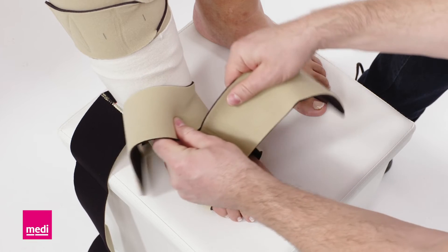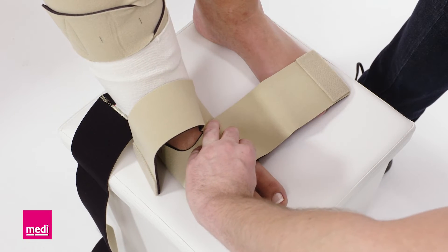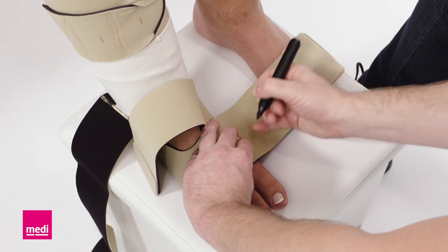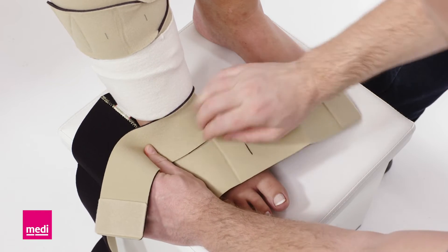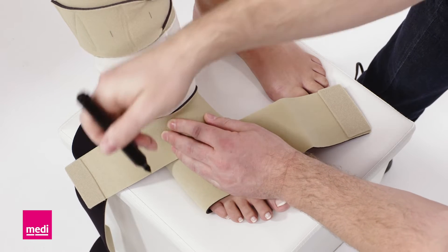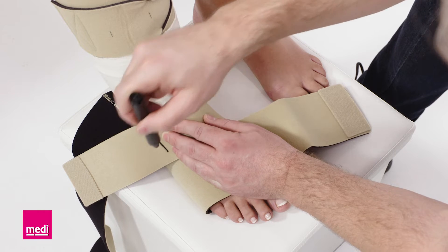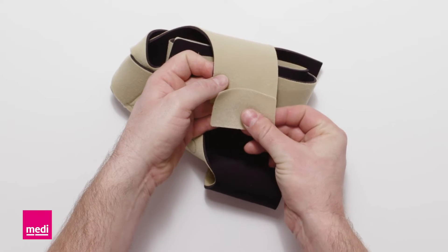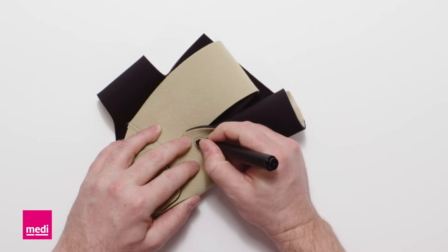Pull the two front bands over the arch of the foot. Mark the points where you want to shorten later. Trim the bands and reattach the hook fasteners. Label the garment for the right or left foot accordingly.